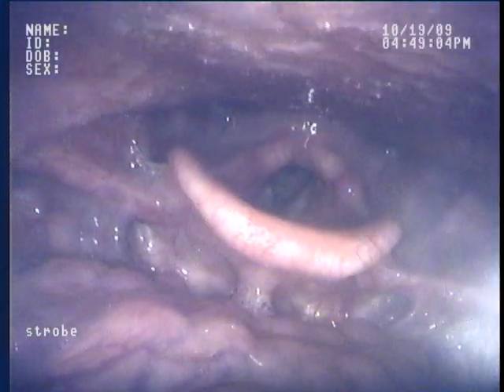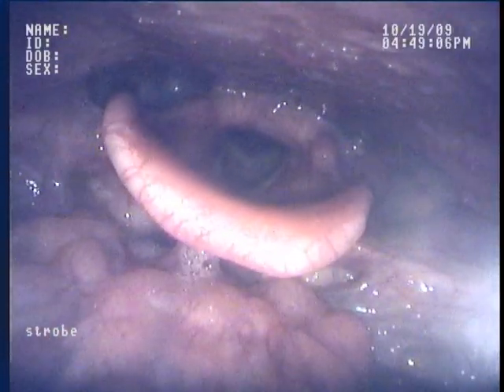This area here is the area above the vocal cords. This structure right in front of us is known as the epiglottis.